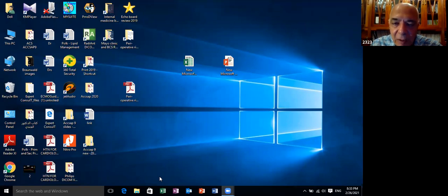الستنت compatible with MRI، لكن الجايد لاينز بتقول انك يستحسن انك تستنى لمده 6 اسابيع. لكن ما هي عباره عن different forms، different materials including stainless steel وكروميوم وكوبالت والالويز منهم، فهي سيف. لكن الجايد لاينز are very cautious للحاجات دي.